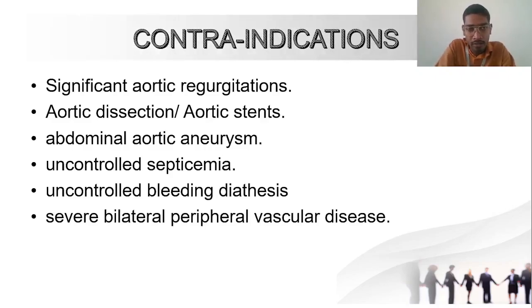And then what are the contraindications for the patient? This is a mechanical supporting device which is placed only in the aorta.